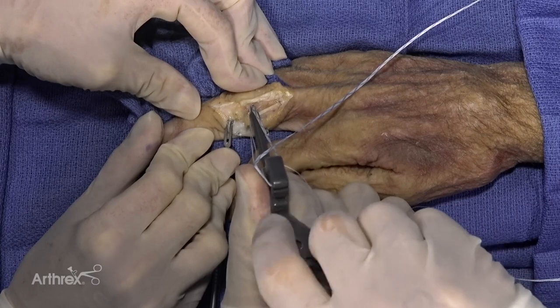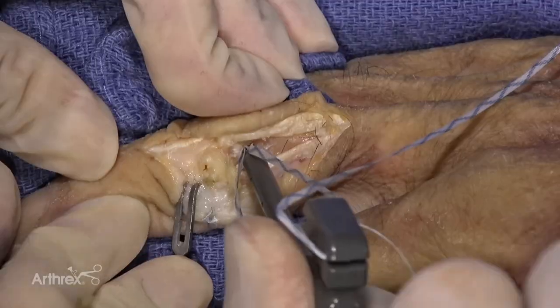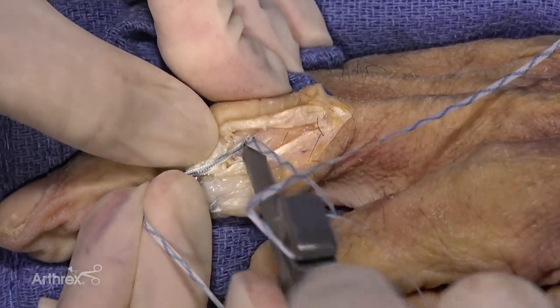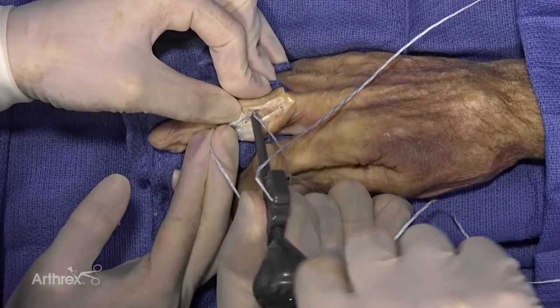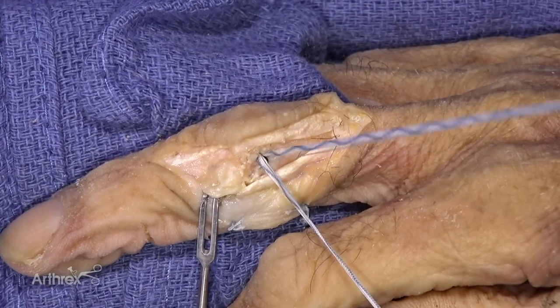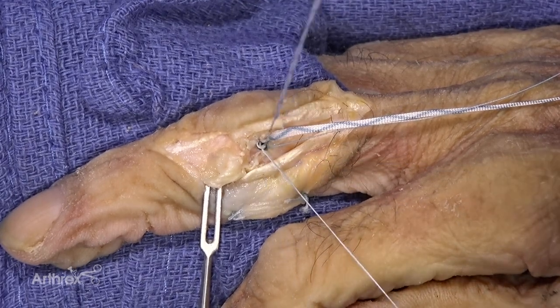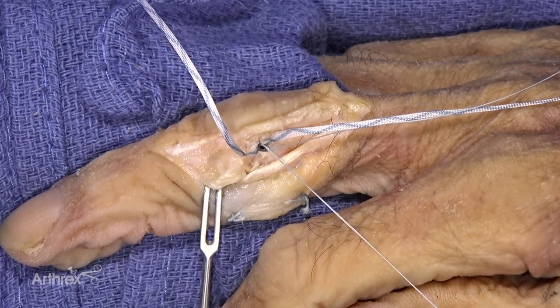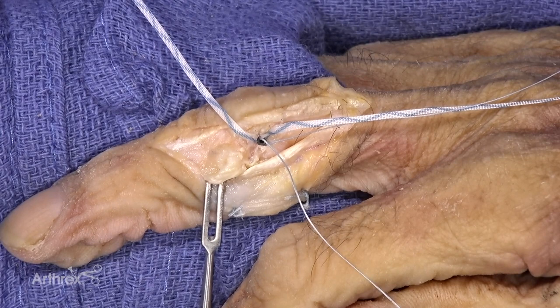It's important to make sure that this anchor body is flush up against the bone before you start to turn the anchor and try to advance it. Although if for some reason you don't do that and the anchor eyelet and the body separate, you can reload these. That's the great part of using swivel lock anchors. So now we've got our suture tape and our 4-0 fiber wire. We'll only be reusing one of the limbs of the suture tape. We'll use that in just a second. For now, we'll use the 4-0 fiber wire to do our repair.